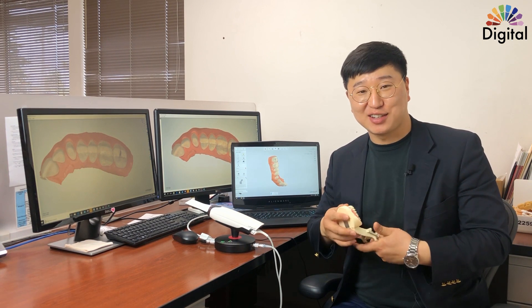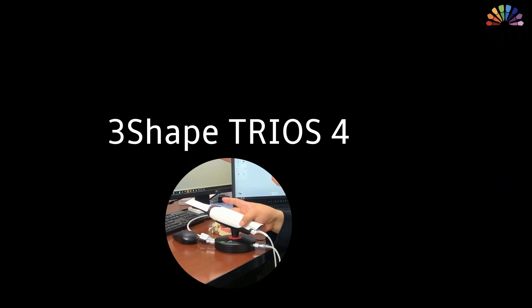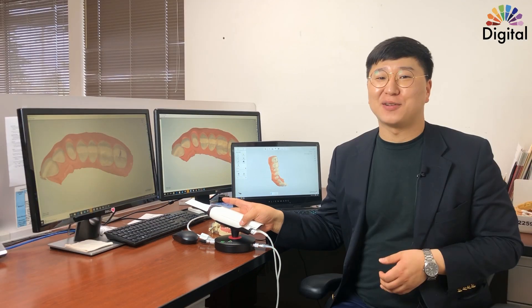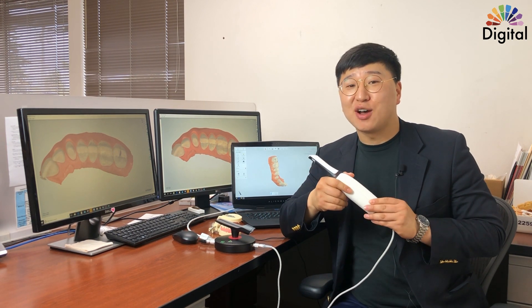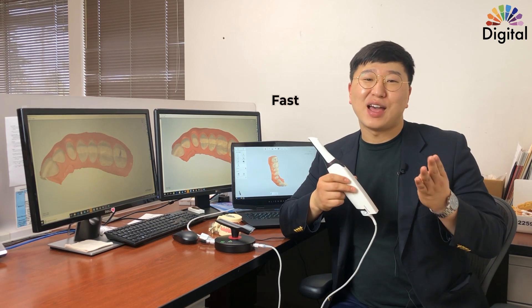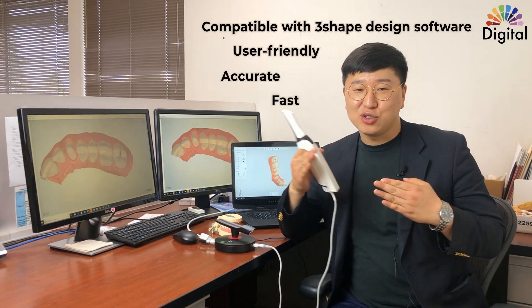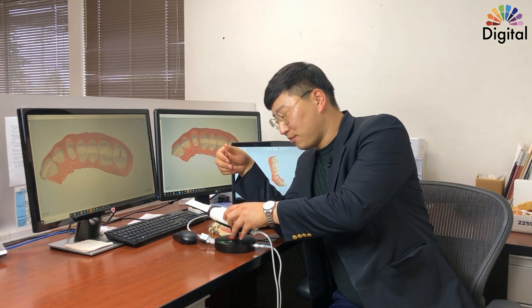Hi everyone, welcome back to Jack's channel. I have a TRIOS intraoral scanner today. I want to share with you guys about the TRIOS software functions. We already know the TRIOS scanner is fast, accurate, and user-friendly, and integrates well with the 3Shape design software. I'm a big fan of both the 3Shape design software and the TRIOS intraoral scanner, because I'm receiving all those intraoral scan files from the doctors.